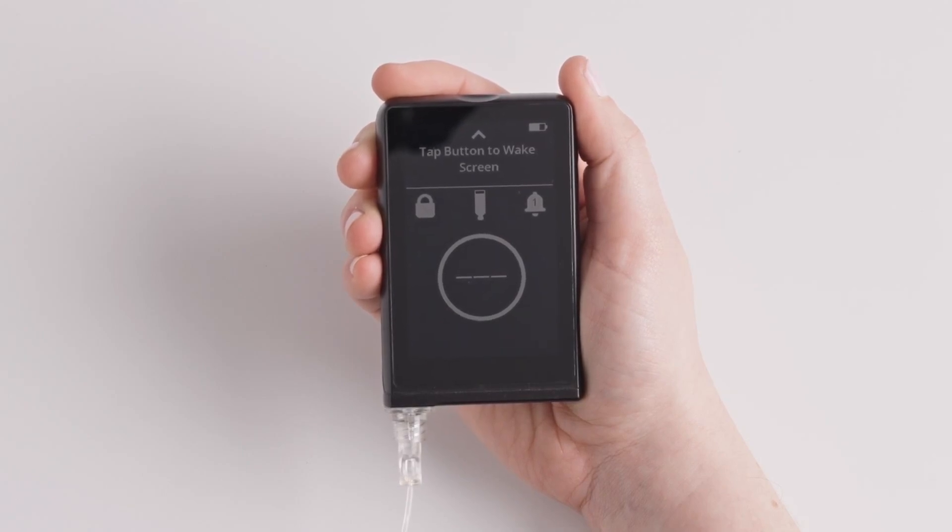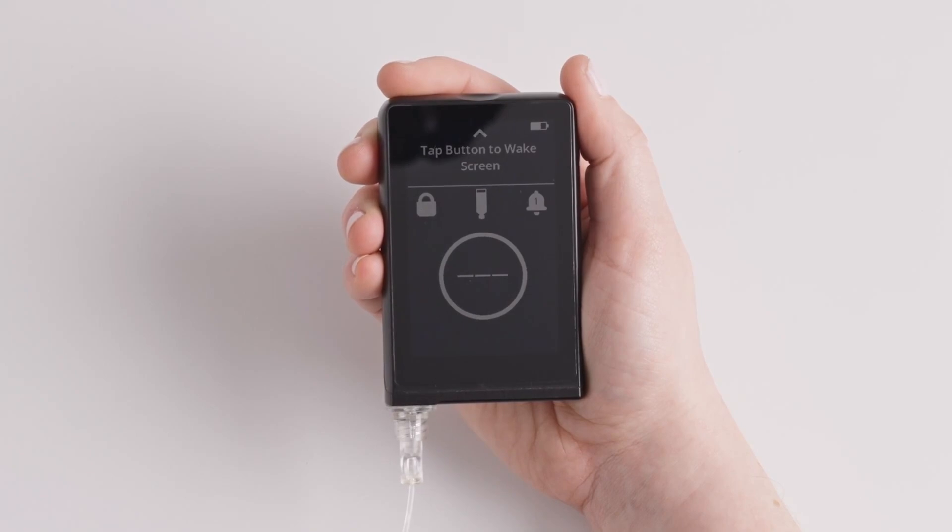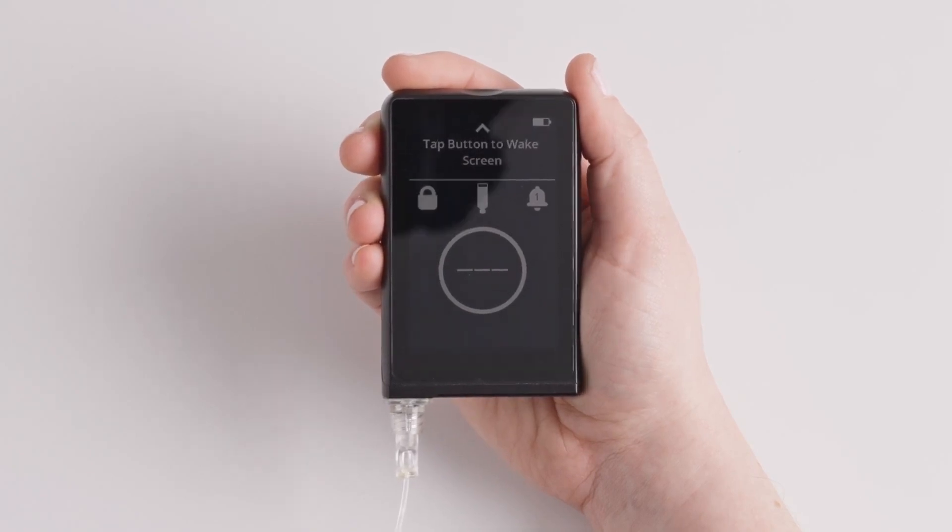If you have an active sensor session, switching the sensor type will stop that sensor session. You will not receive glucose readings or alerts until you start a new sensor.